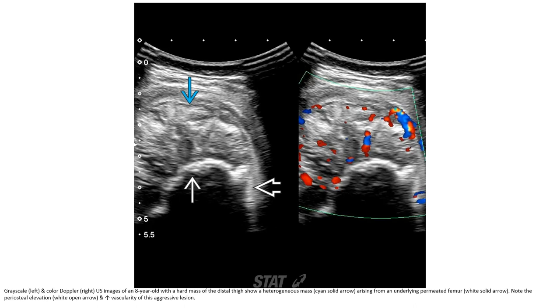This is an ultrasound with color Doppler of an 8-year-old with a large mass, showing a heterogeneous mass arising from the underlying distal femur, with noted periosteal elevation.